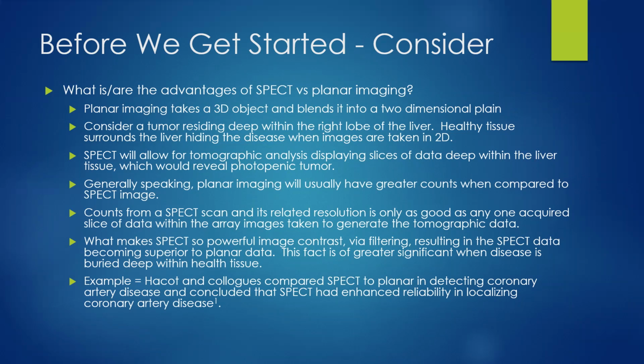SPECT, however, allows us to do tomographic analysis, and it displays the slices that are actually deep within the liver, allowing us to find that photopenic tumor. Generally speaking, planar imaging will usually have greater counts compared to SPECT. So, hey, maybe that's a problem.